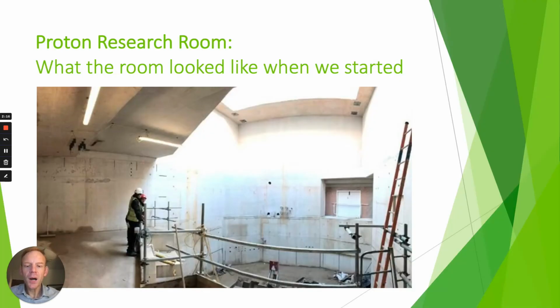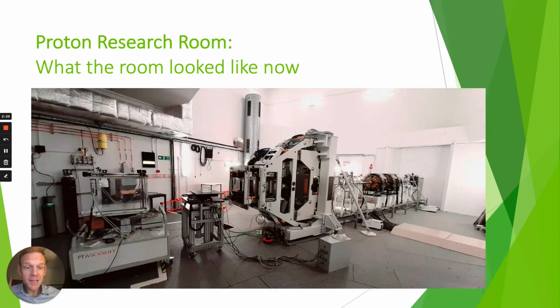Of course, part of the challenge was, this is what our proton research room looked like at the moment. We hadn't even finished designing the research beamline at this stage, and we were definitely in the middle of building it. Our room has evolved a little bit since then. Here it is without the proton hypoxia cabinet in it, but you can see the very large scales of the scanning nozzle and the other pieces of equipment, highlighting what a complex challenge this was.